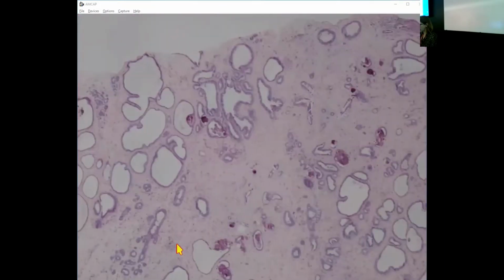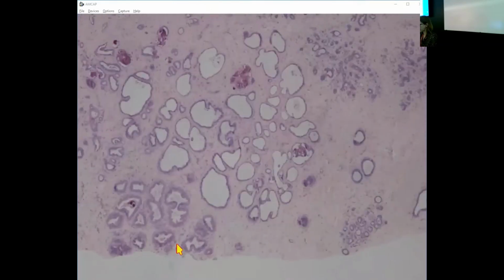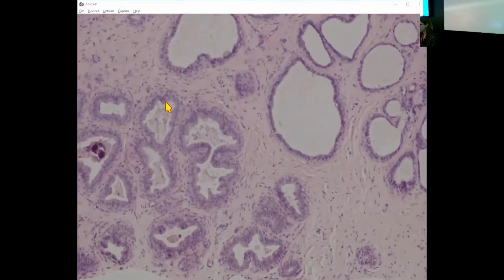So this kind of appearance, some of them you'd categorize just as microcysts, but when you have multiple like this within the terminal duct lobular unit, I make my primary impression about whether it's flat epithelial atypia or not on low power. And it didn't look like FEA to me. It wasn't monomorphic, and the irregular contour of the spaces favors columnar cell change or columnar cell hyperplasia. You can see we've got columnar epithelial cells there.